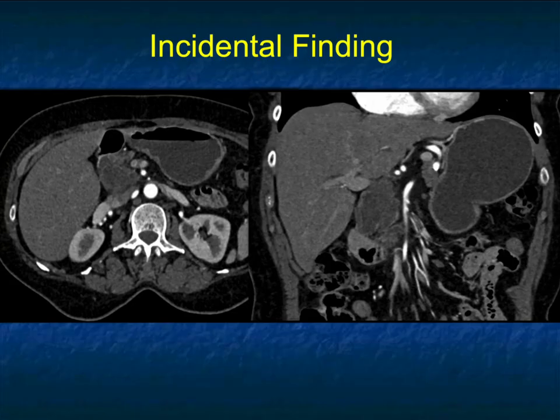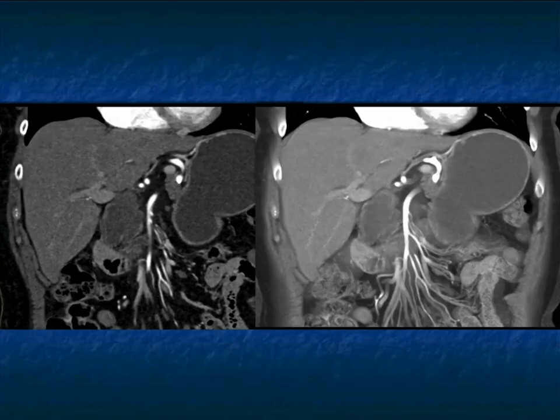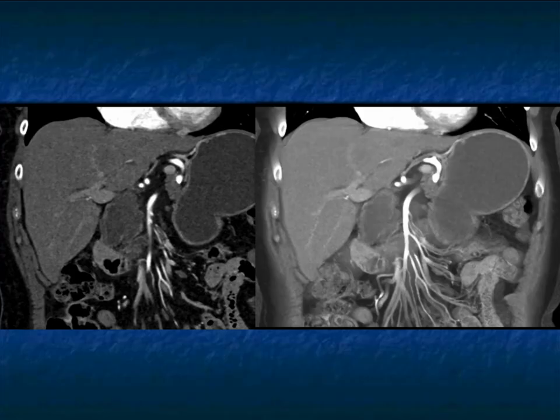Here's an example of a cystic lesion in the pancreatic head. The problem: it's over three centimeters, with slight wall thickening, septations, and slight irregularity. When you see that on coronal or volume-rendered view, and you start seeing a thickened wall or septations — particularly with that size — you need to evaluate further. This is not someone I'd bring back in six or twelve months; I would send them for EUS and fluid sampling. There's a lot of work from Hopkins and University of Pittsburgh where fluid sampling can predict cancer risk.